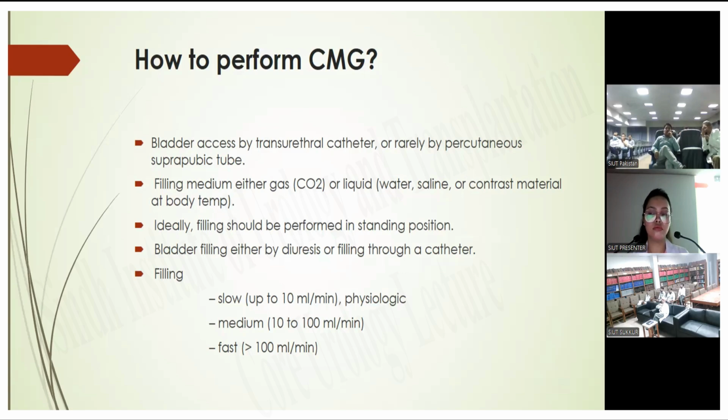So fluid should be increased slowly, and you should also refer to the bladder diary, and that is the prerequisite for that. Now, there is another logic behind slow flow. If the transducer is directed towards the trigone and you increase the flow, then trigonal stimulation will raise the pressure and cause the first sensation to come up earlier than it should. If you want that anomaly taken out of the context, don't start with something like greater than 100 ml. The safest point is to start with between 10 to 25 and then move on, as has been said.